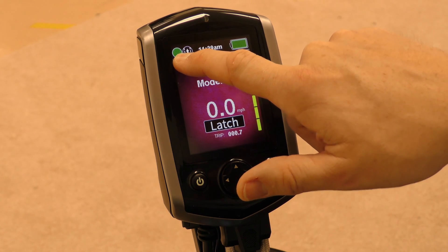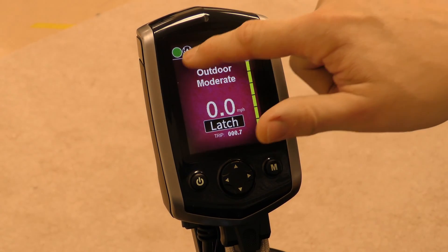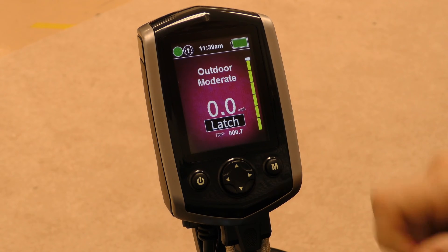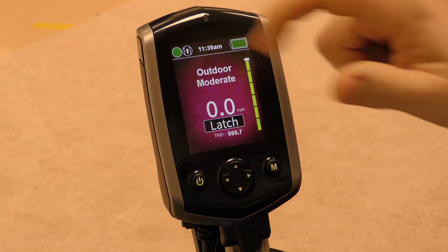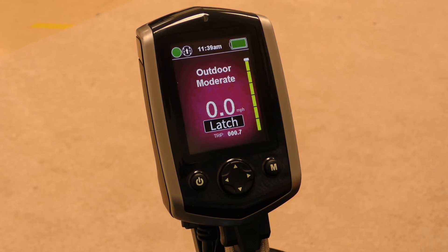Green means the chair can drive at full speed. If it was yellow, it would be in a speed reduction mode. And if it was red, it would be in a drive lockout.